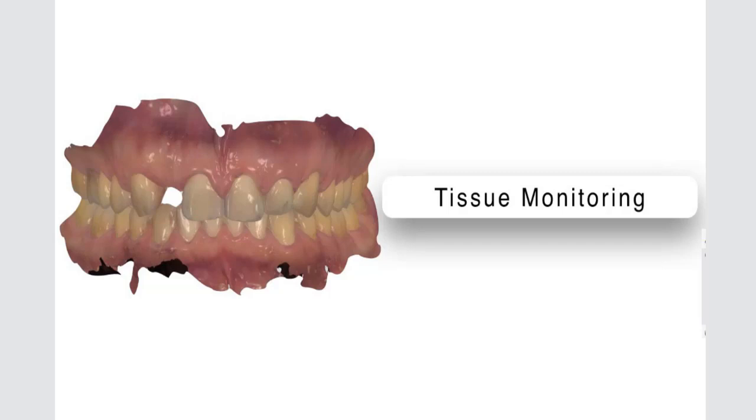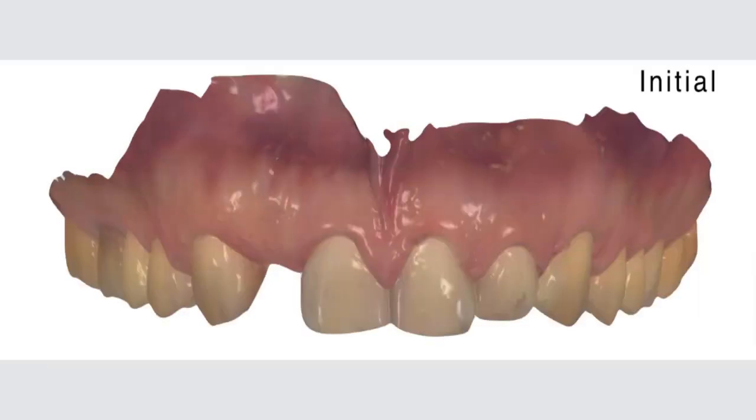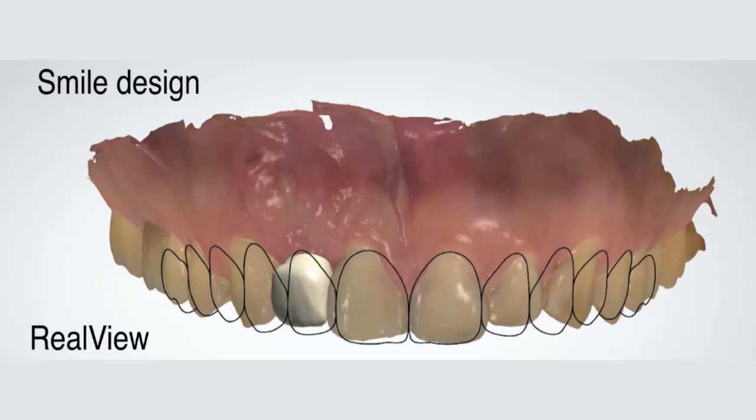So here's one case that I will go over, missing the number 12. In the US, this would be the number 8. No, I'm sorry, the number 7. I don't know, one American guy can correct me, but this is the number 12 in the European standards. And when I start looking into it, okay, the patient is looking for an implant, and let's see how we develop that.